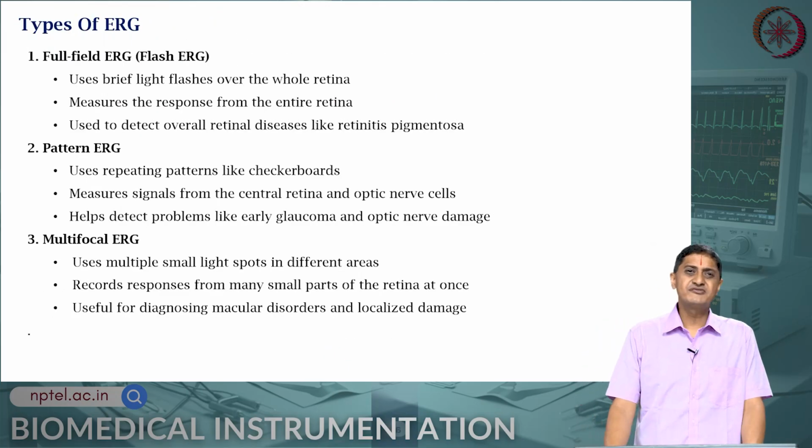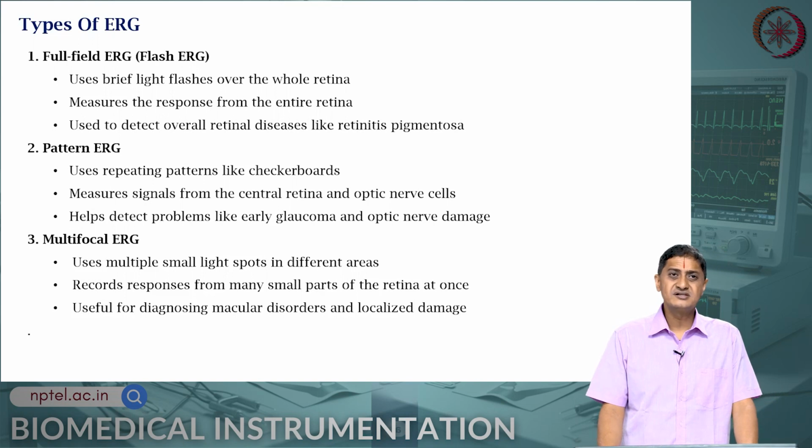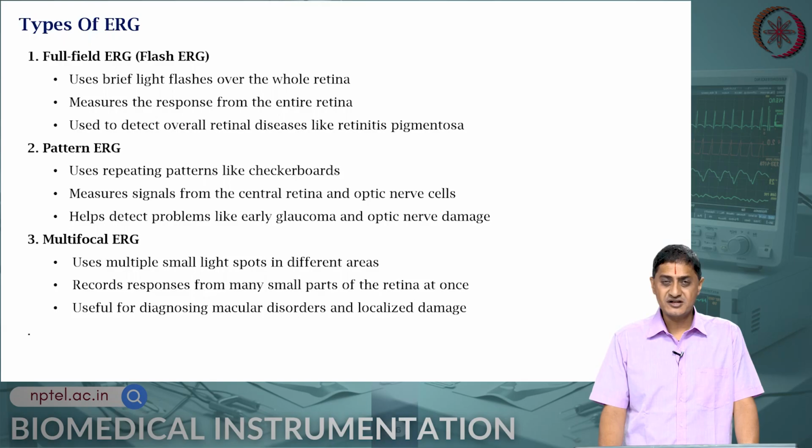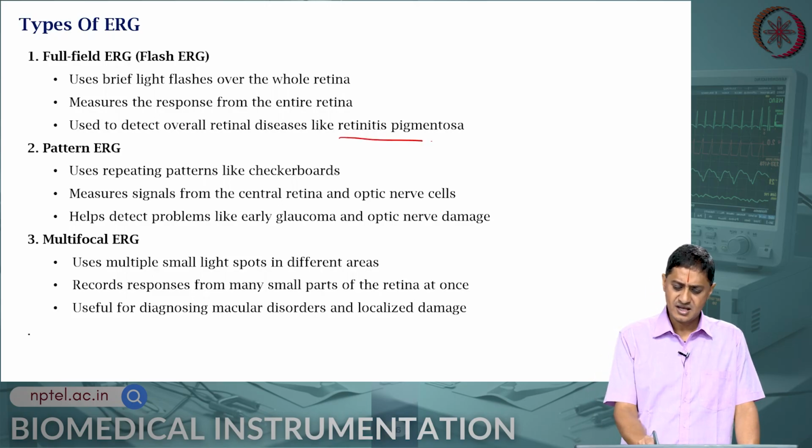There are different types of ERG. Full field ERG essentially uses brief light flashes over the entire retina and measures the response from the entire retina. This is used to detect overall retinal diseases like retinitis pigmentosa.